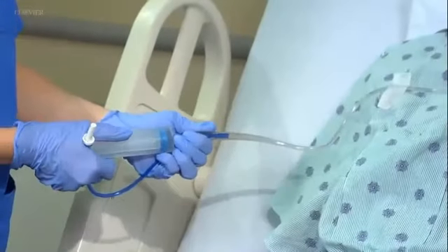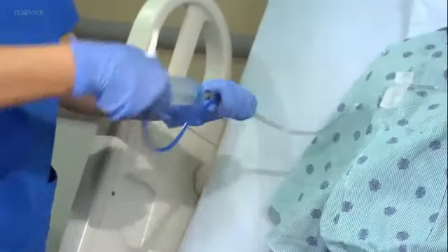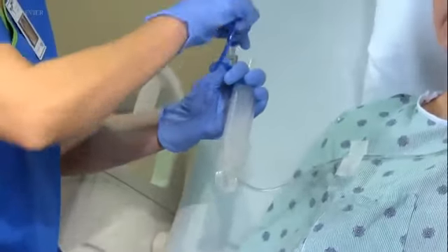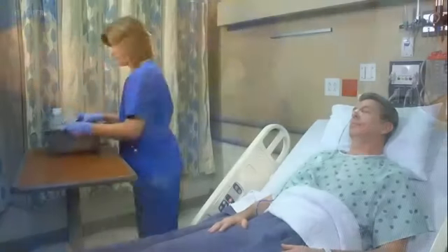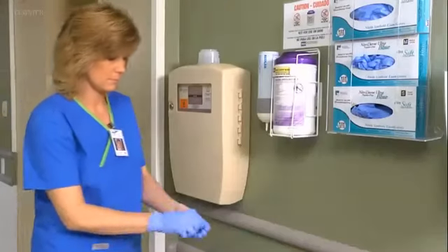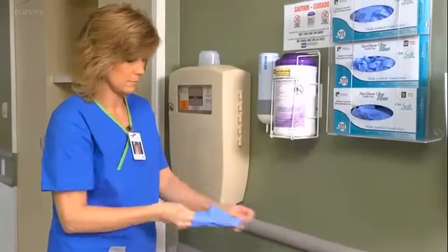When the water has been instilled, remove the syringe, reconnect the tubing, and reinstitute the tube feeding or administer medication as ordered. Dispose of used supplies. Remove and discard your gloves and perform hand hygiene.